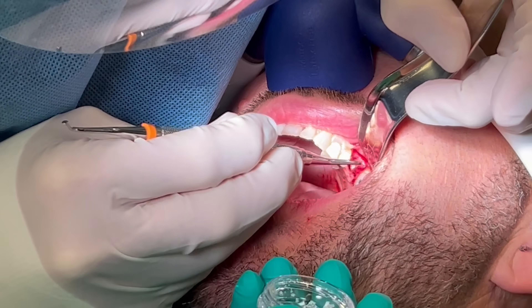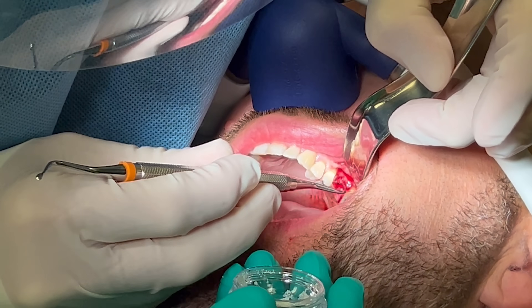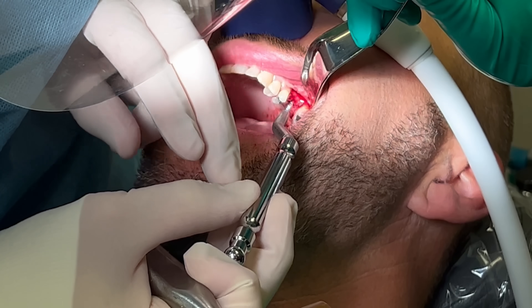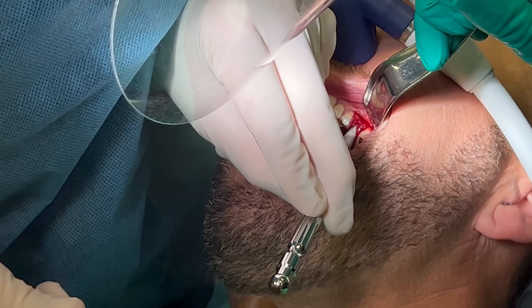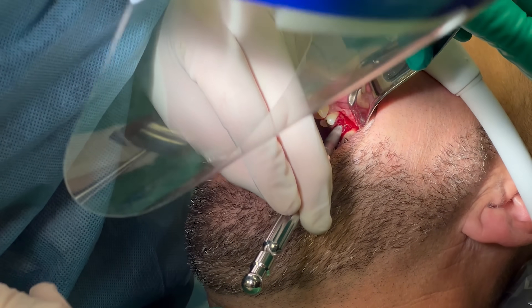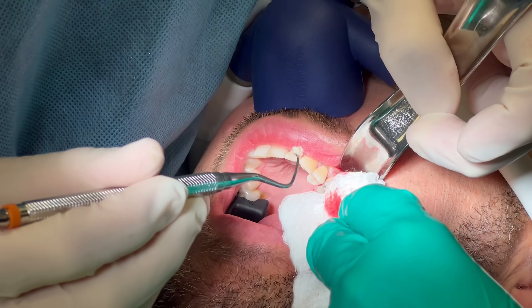Now that the bone is prepped to the depth that I want, I begin to elevate the sinus using bone graft material and osteotomes. The great thing about osteotomes is not only do they elevate the membrane, they also condense the lateral walls of the osteotomy, so the implant is engaging in more compact bone. The posterior maxilla is the least dense tooth-supporting bone, so this compaction is very helpful for implant stability.